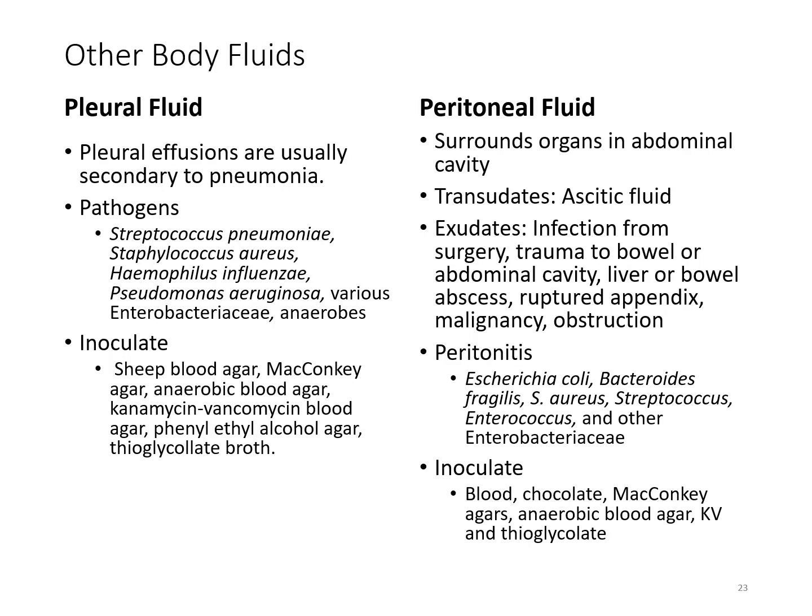Pleural fluid, this is the fluid that is around the lungs, and it's usually going to be secondary to something like pneumonia. Here we have the infections listed, as well as the media that are typically used to inoculate it.